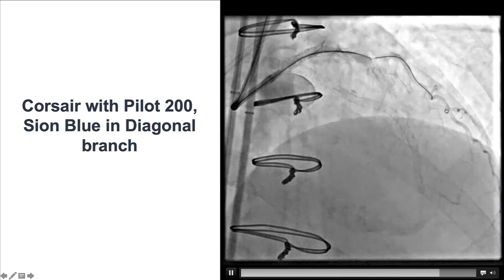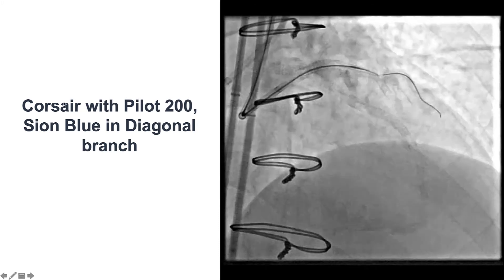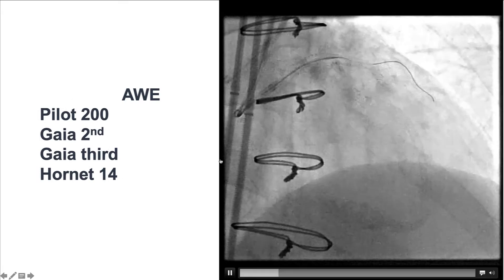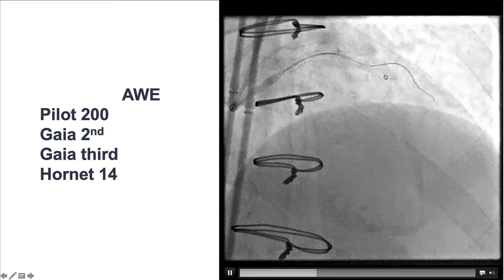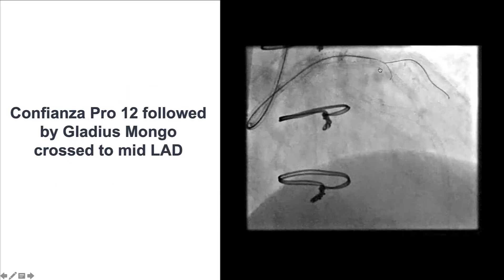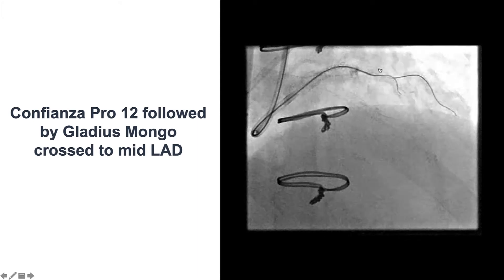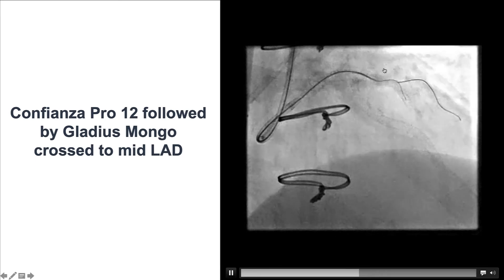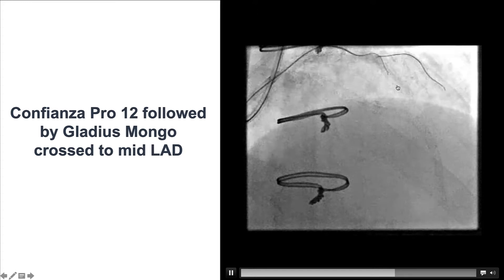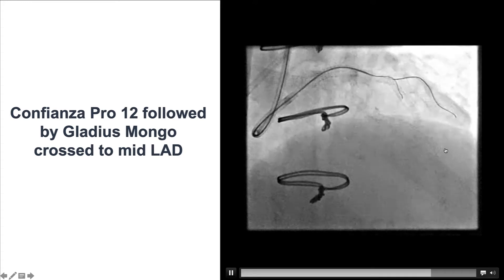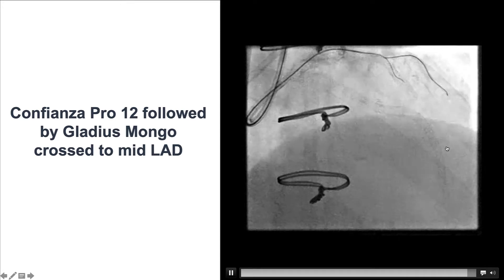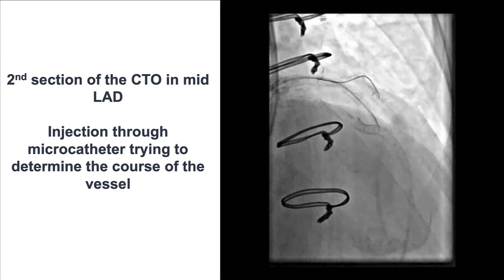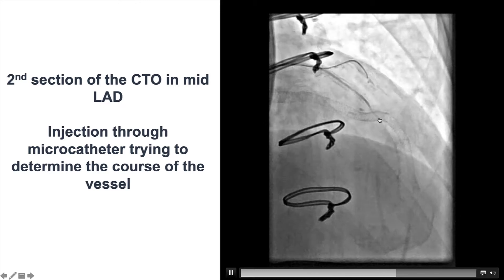We inserted a safety wire in the diagonal branch and performed antegrade wire escalation using a Corsair. Multiple guide wires were used: Pilot 200, Gaia 2nd, Gaia 3rd, and Hornet 14. Advancing guide wires through the previously placed stents was very challenging. Eventually, using a Confianza Pro 12, we were able to partially penetrate into the old stent, advance our microcatheter, and then use a Gladius Mongo to advance further down toward the LAD. We inserted our Corsair to the mid-LAD and performed injection through the tip of the Corsair, but that was not very useful — we could not determine the course of the vessel from this injection.